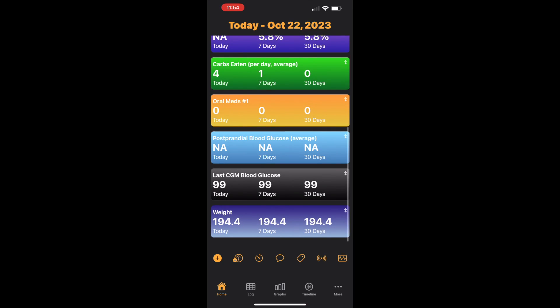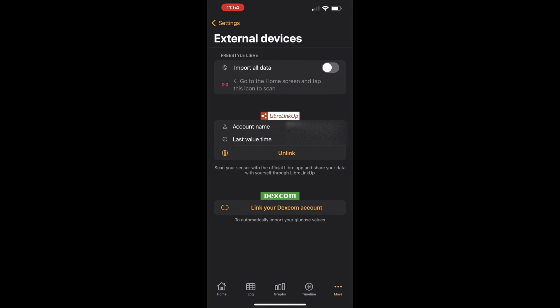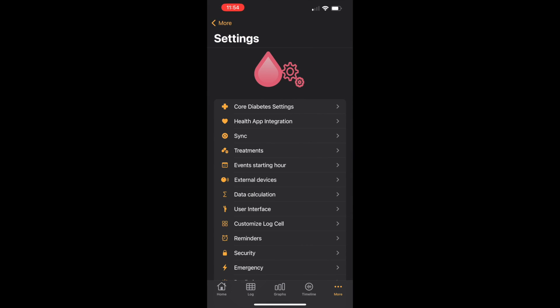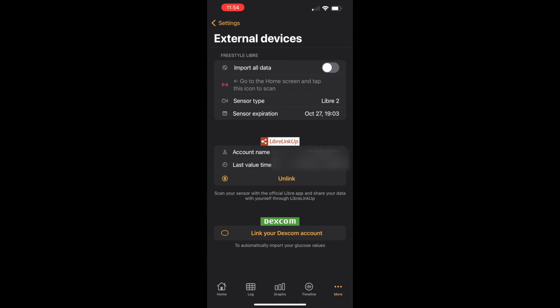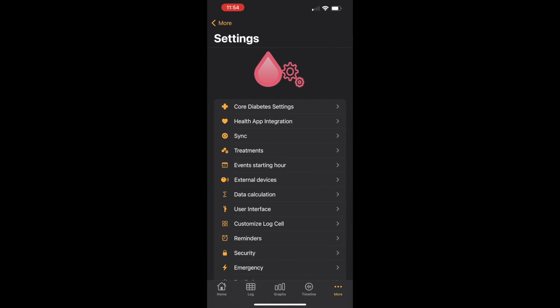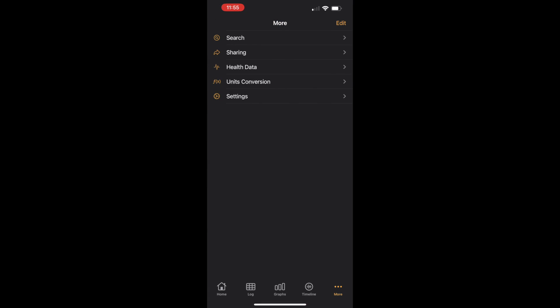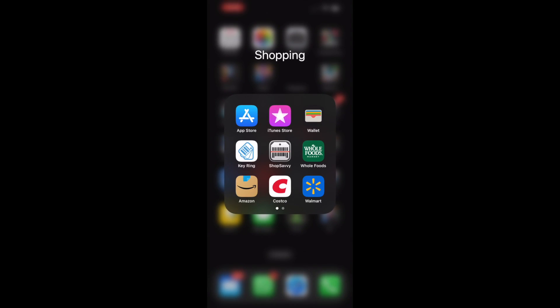To connect it, you go into Settings and External Devices. You'll put in your Libre Linkup login info, and it bridges from Libre Linkup to this app, which writes it to Apple Health.